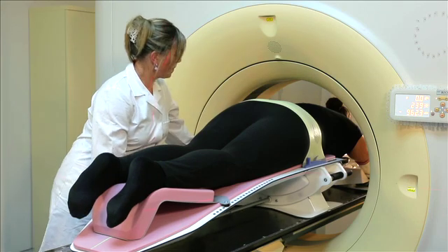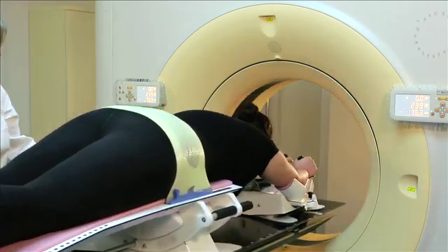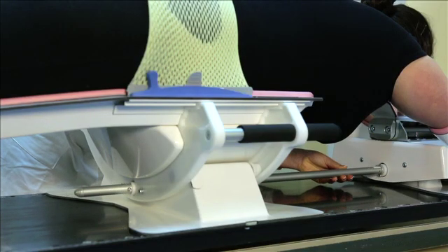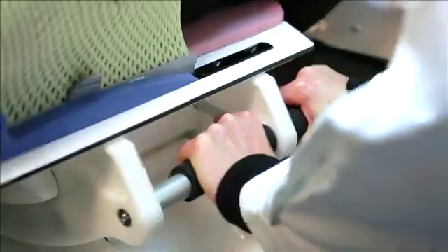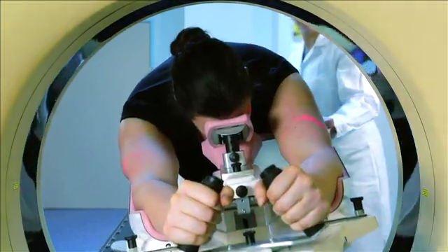If a tilt is necessary, a new scan must be taken. To tilt the patient, move the metal shaft forward again to connect both parts of the system. Stand to the side of the patient, pull the two handles towards you, and push the system to the desired angle. Pull the metal shaft backwards again and perform a new CT scan.